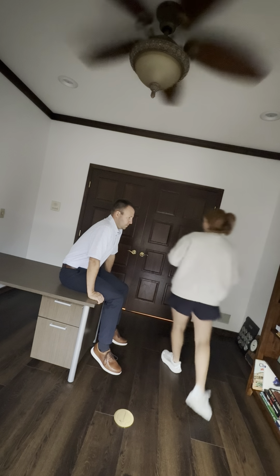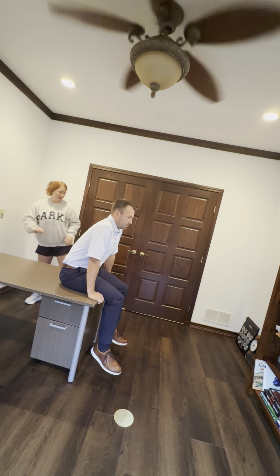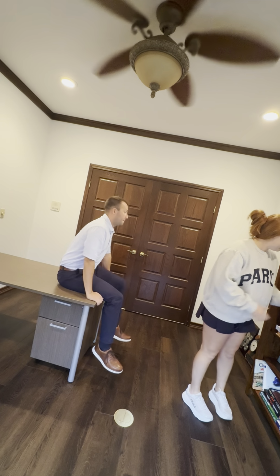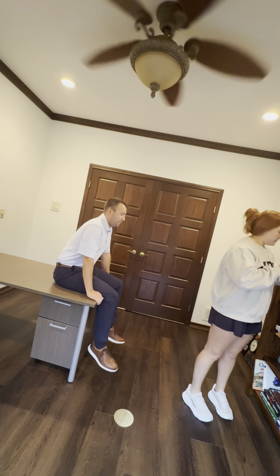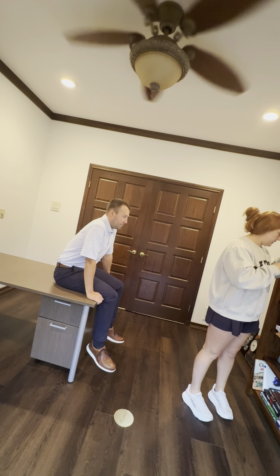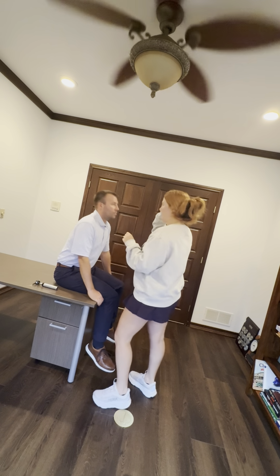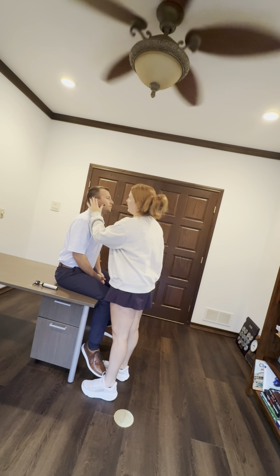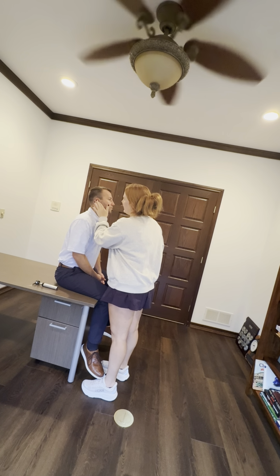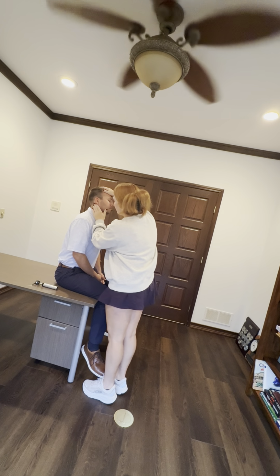Okay, I'm going to turn the lights back on. We are done with the eye portion of the exam, and the next portion is looking at your ears. So I'm going to get this ready. First, I'm going to start by touching and feeling your ears. If there's any pain or tenderness, let me know. Checking the auricle, the tragus, any pain? No. And I'm going to palpate your mastoid.